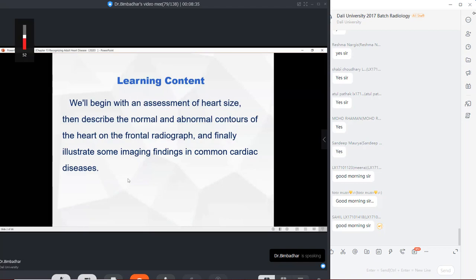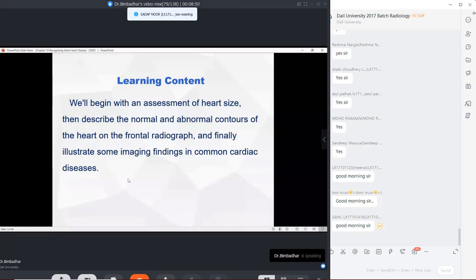So, in understanding a cardiovascular status, the first thing a radiologist should always do is assess the heart size, which means measuring it, because of a simple physiological fact: the heart is a mobile structure, continuously contracting and relaxing, which is called systole and diastole. And then it is circulating blood all over the body and receiving blood from the body. So the heart size has some relation with its pressure gradients.